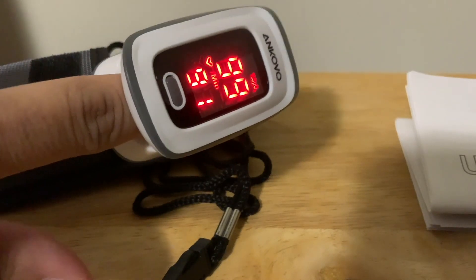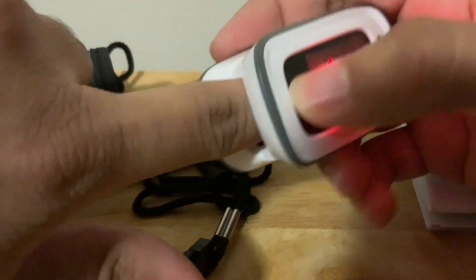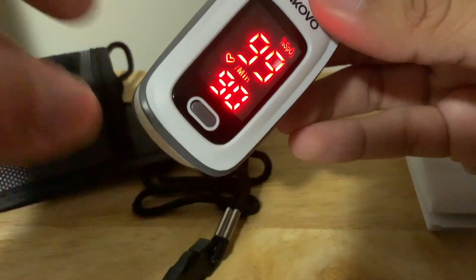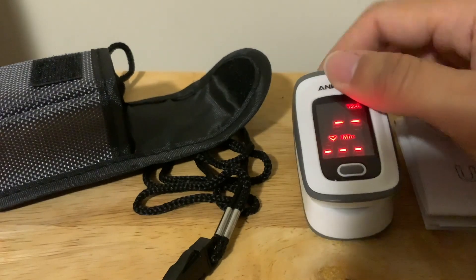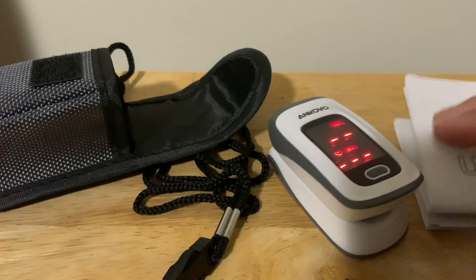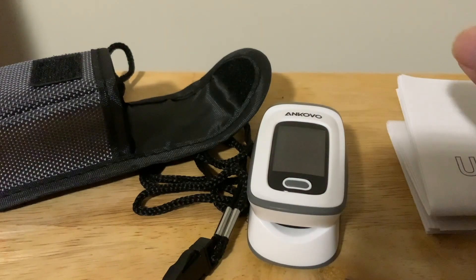Pretty cool. And then just take it away. I think it turns off by itself — yeah, it turns off by itself.